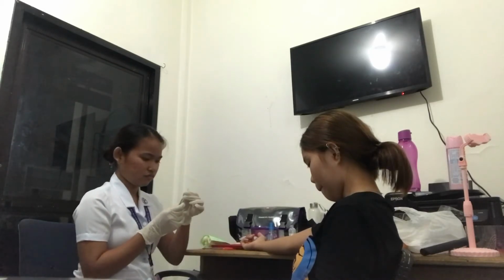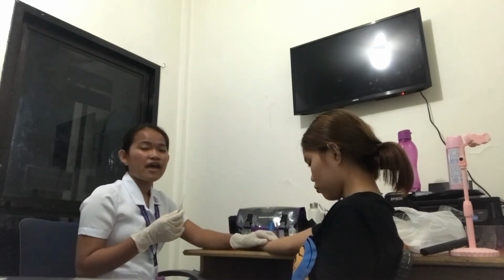After that, we need to remove the cap and hold the syringe between the thumb and the forefinger of your dominant hand with the bevel of the needle pointing up. Now we need to stretch the skin at the injection site by pulling gently with the thumb and forefinger of our non-dominant hand.